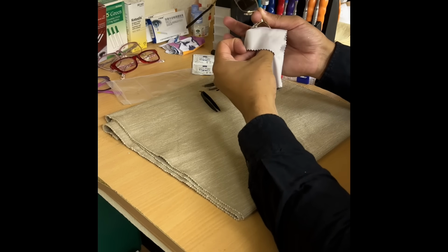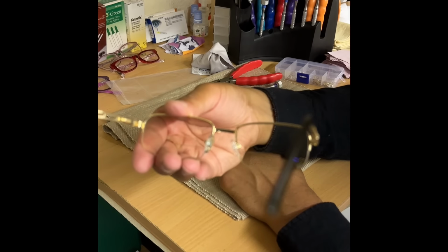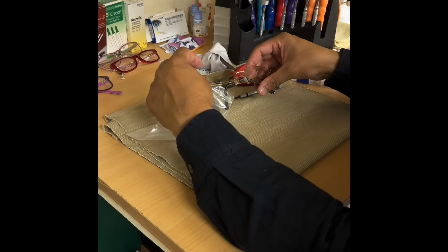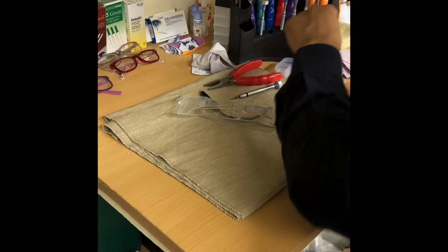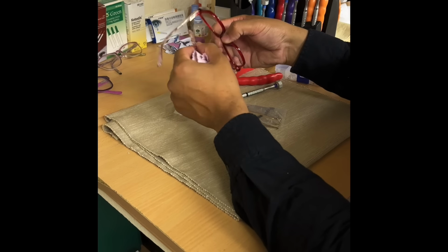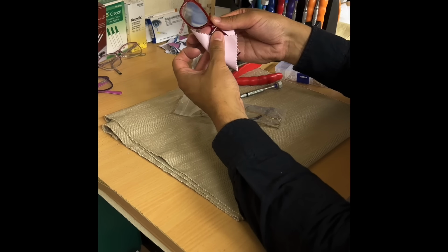Okay, D-segment bifocals. How are you getting on with your bifocals? There we go. Are you happy with that? Please try them on. Okay, so I'll give you those to take away. I'll pop them back in the bag, considering you don't have your lens case. I'll include a nice microfiber cloth for cleaning your lenses. So I'll spray them with your special solution. You like to use the thumb and middle finger, front and back, like so.